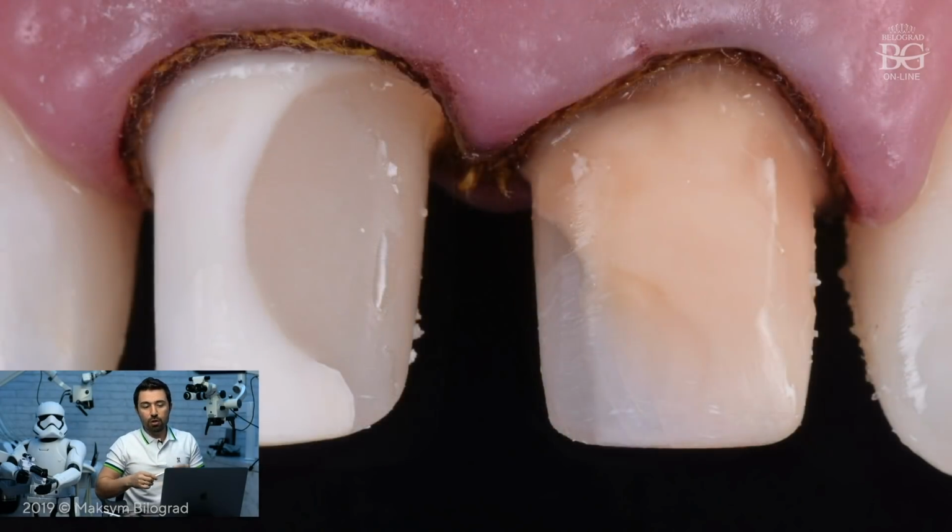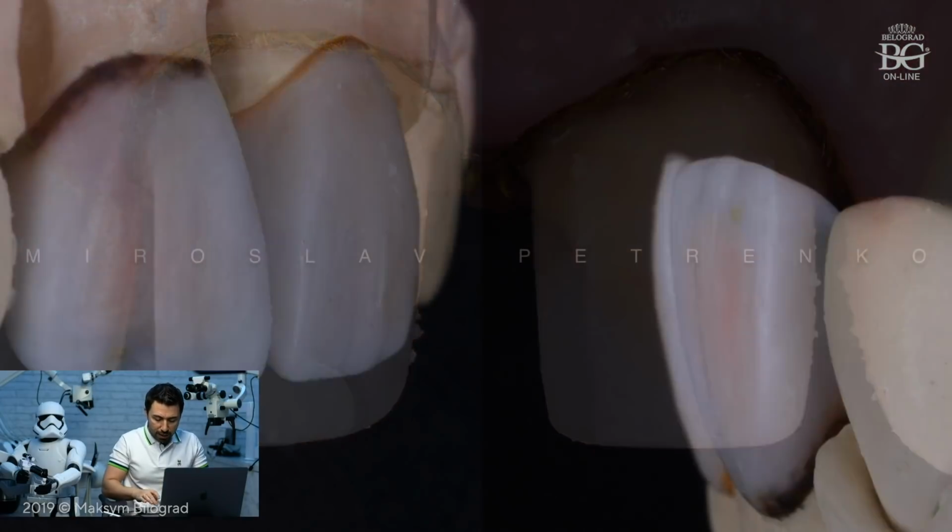And this is the picture before the final impression. In that case we do the impression with a double cord technique. The first cord is in the sulcus, another cord is over it, one size bigger. We put the second retraction cord, then we remove the second retraction cord, and then we take the impression. These impressions were sent to the dental lab.